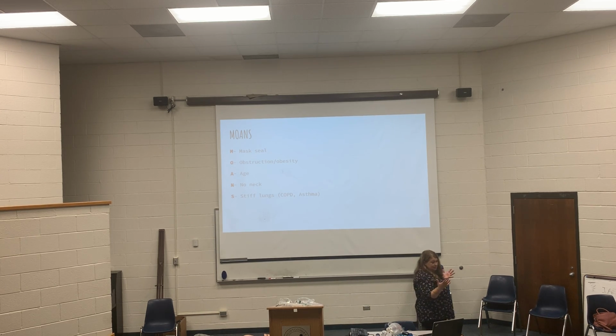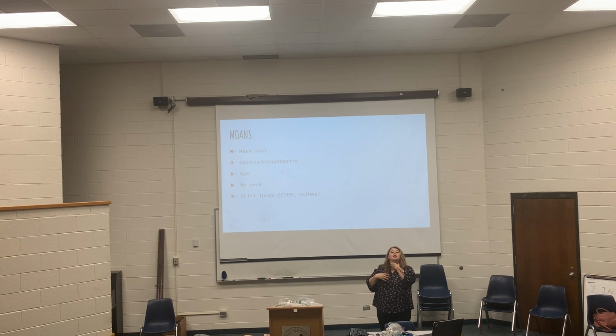Or the obesity, it's an epidemic. I have a much more difficult airway than Veronica does, just because I am bigger, so you might have to adjust more, or maybe even put a rolled towel under their neck, so that way it opens that airway more.